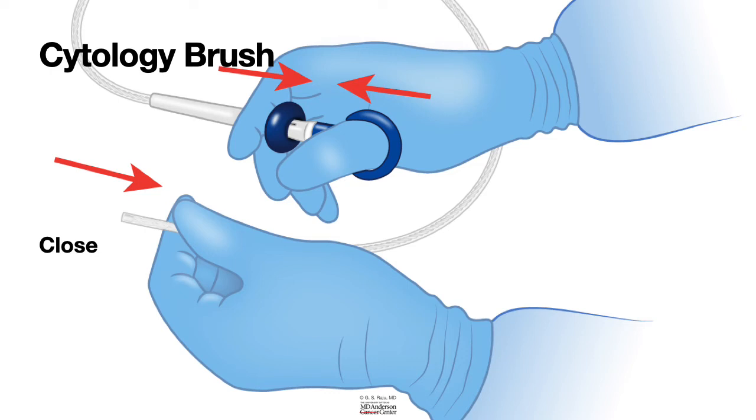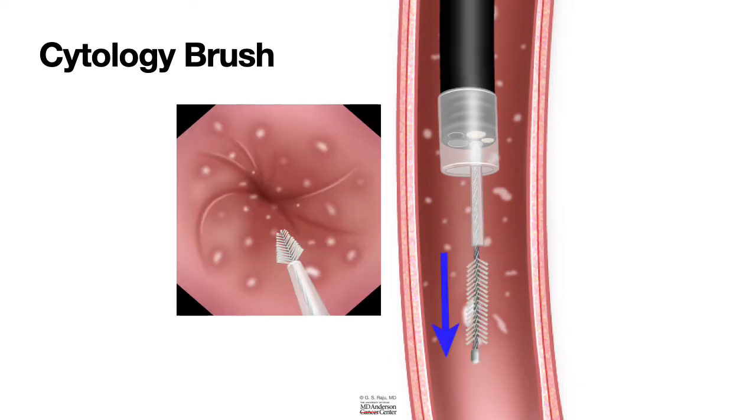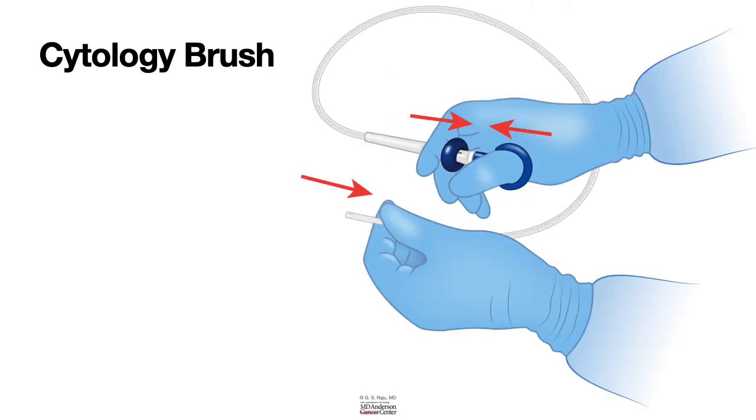The endoscopist then inserts the brush catheter into the biopsy channel, and when it comes out into the operating field, it is still in a closed position, and he will ask the assistant to open, and the brush will come out. The endoscopist moves the brush catheter in and out of the channel so as to scrape that yellowish plaque material. And once he's happy with that brushing technique and obtained enough material, he will ask the assistant to close the brush. That will pull the brush back into the plastic sheath, and once it's in a closed position, the assistant takes it out of the biopsy channel.